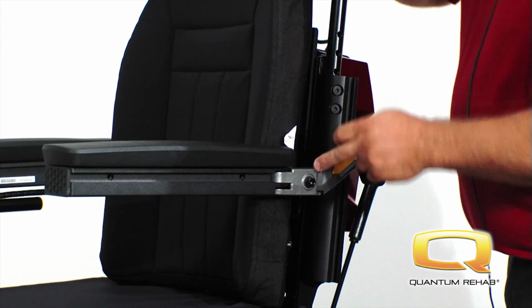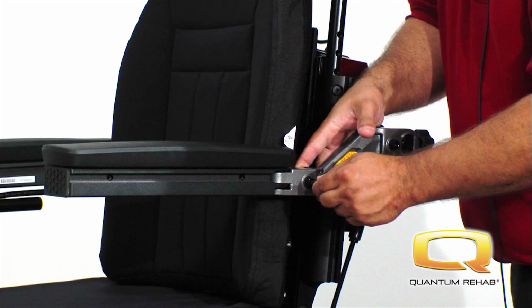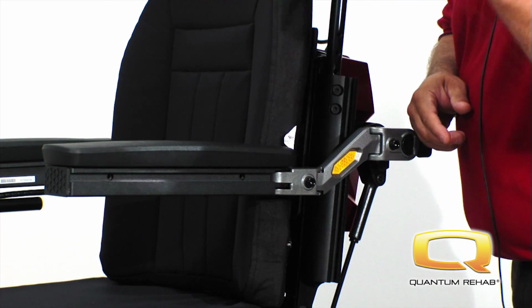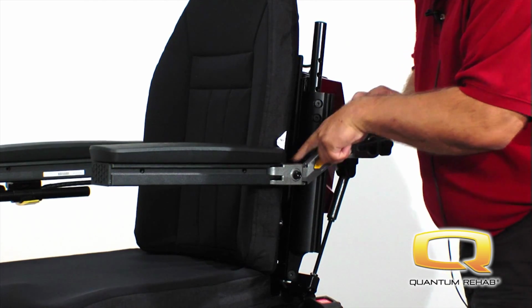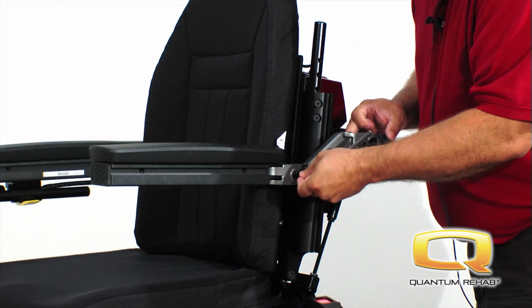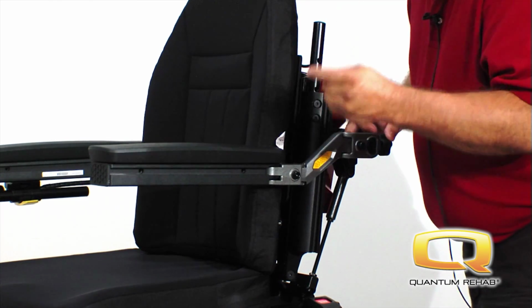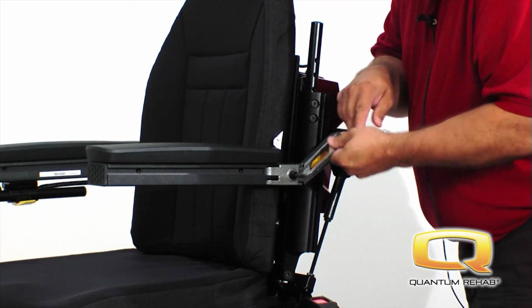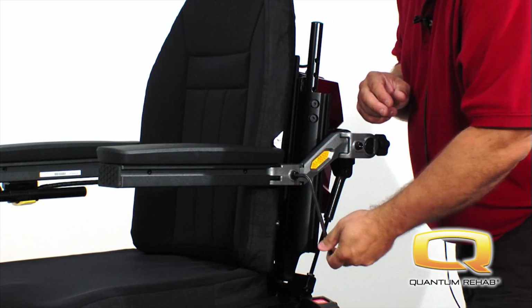On the inside of the arm, on the opposite side of this Allen head over here, there is a bolt assembly. If you've noticed, I used one tool. There are not two tools. I do not want to see a wrench on this side or a wrench on this. If you put a wrench here and put a tool on it and then spin, you'll actually break the arm. So only one tool is required, and it's on the outside of the arm, and then you do your adjustment. When you see the inner bolt spinning, it is meant to spin.